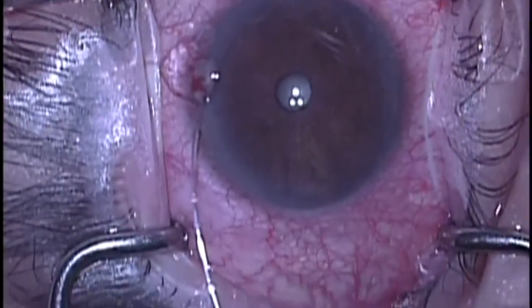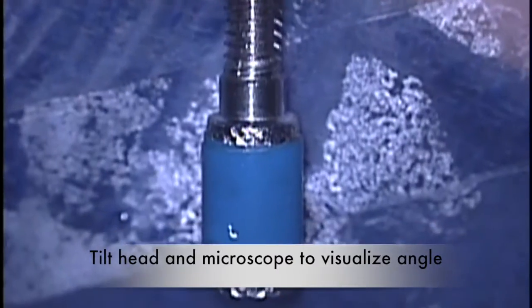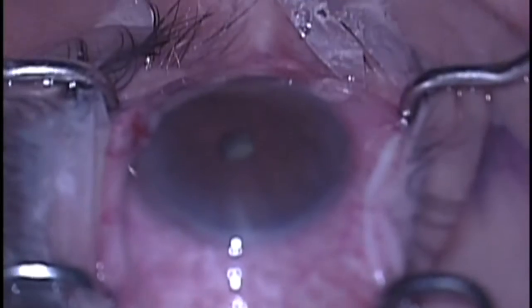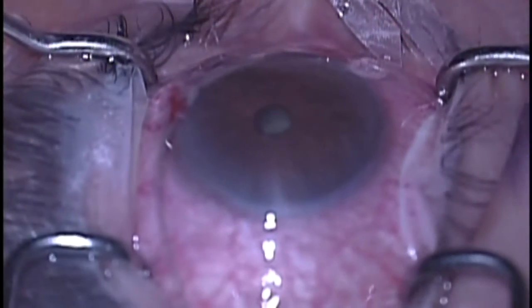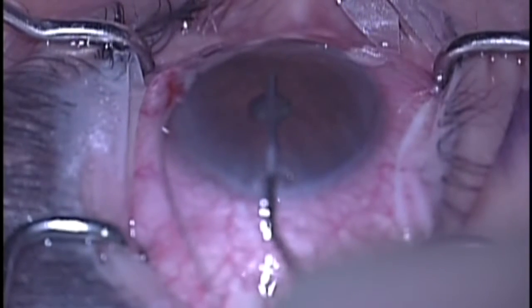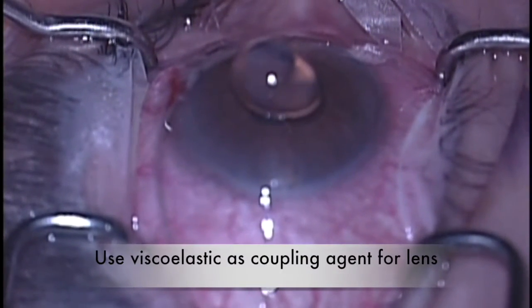In order to obtain good visualization of the nasal drainage angle, the patient's head and microscope are both tilted. The anterior chamber is then reformed again using viscoelastic, and the same viscoelastic can be used to act as a coupling agent for the gonio lens.